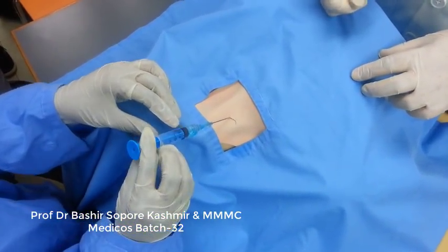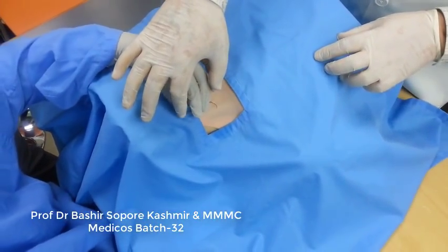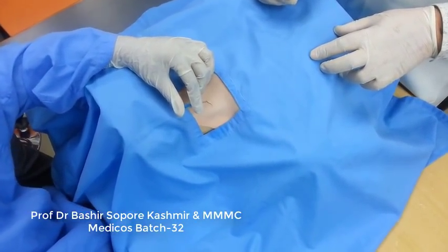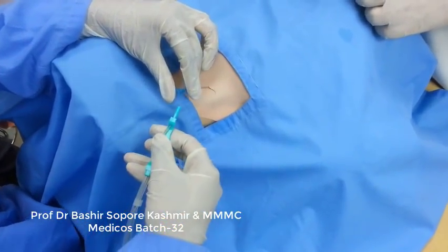After this, what is the next step you will do? Take out the syringe, but put your finger on, because you have to close the port. Then you put the guide wire. The guide wire is to be first straightened.